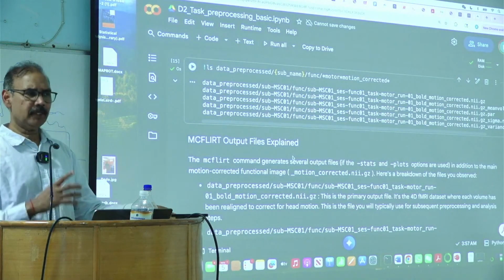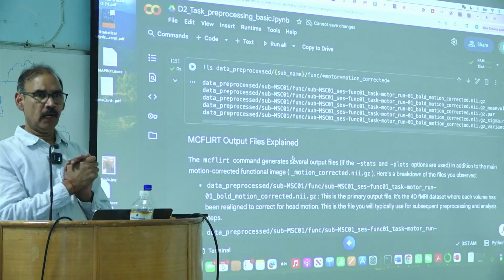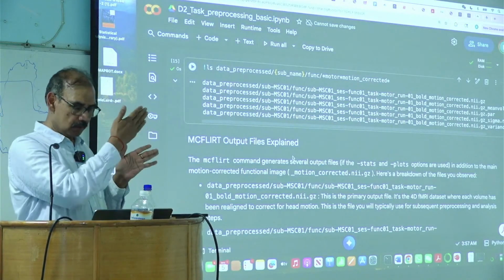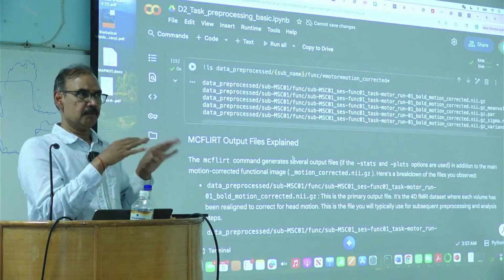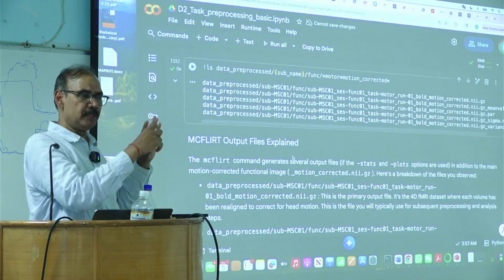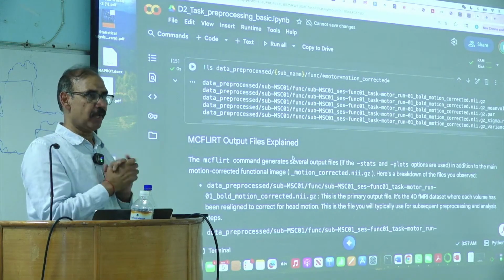You can, but you cannot use the parameters I have used here, right? Because in DTI, maybe the analogy is there is an object and you have taken pictures while the object has moved, but everything else has remained the same, right?